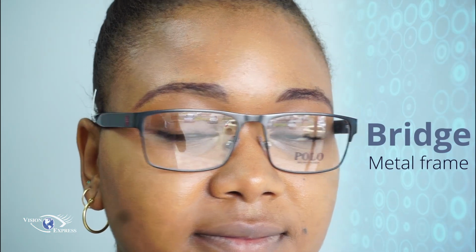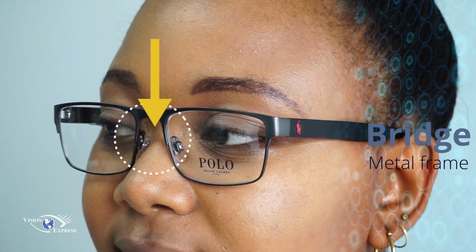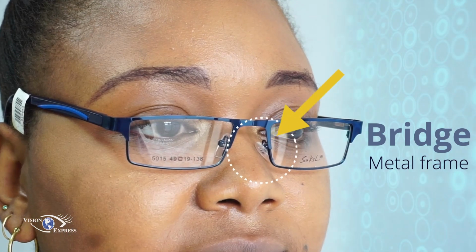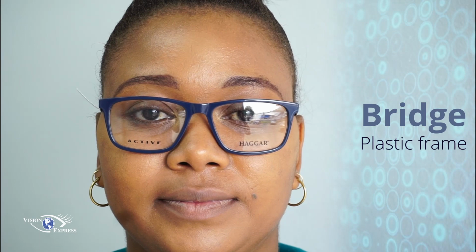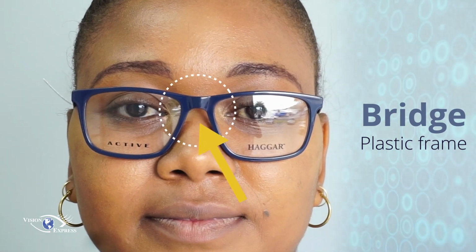The bridge. In a metal frame, the nose pad should rest flush on the patient's nose. If it does not, as in the photo, the nose pads need the necessary adjustments. In plastic frames, if the bridge is too small, it creates tension on the sides of the nose. When the bridge is too high, it does not rest properly on the nose, leaving a gap between the nose and the frame.